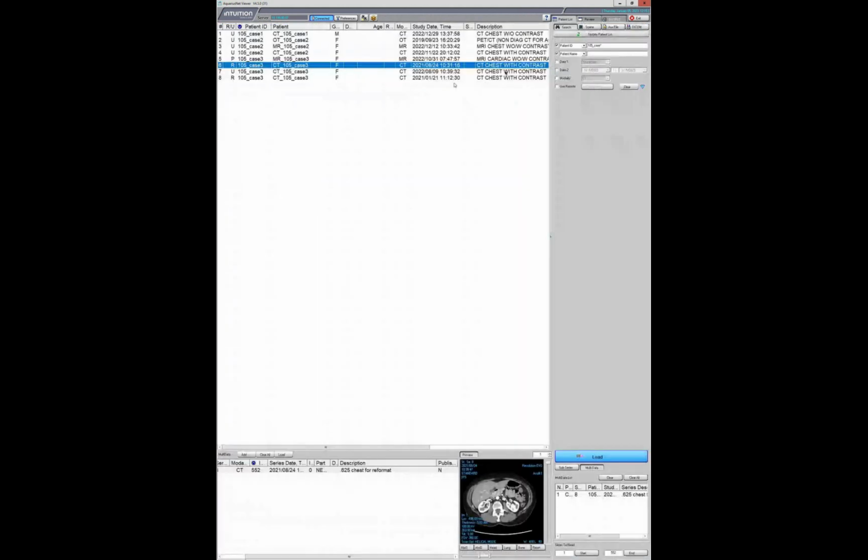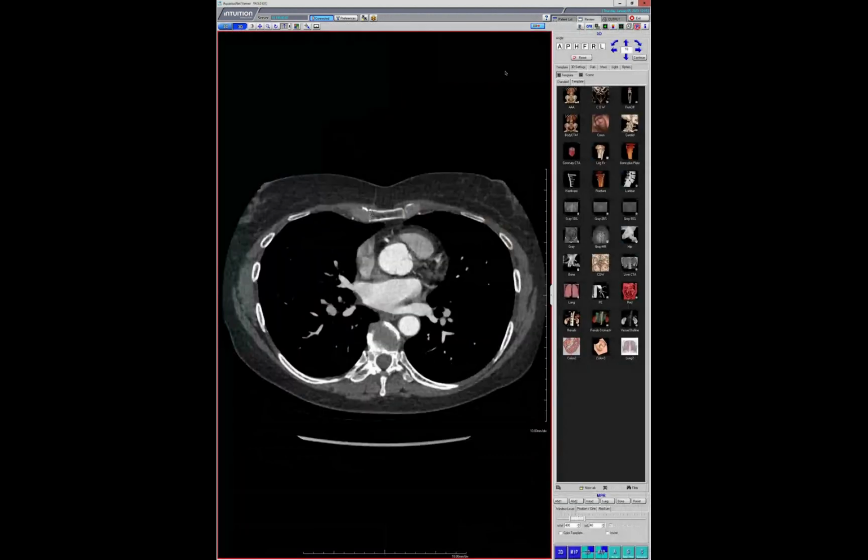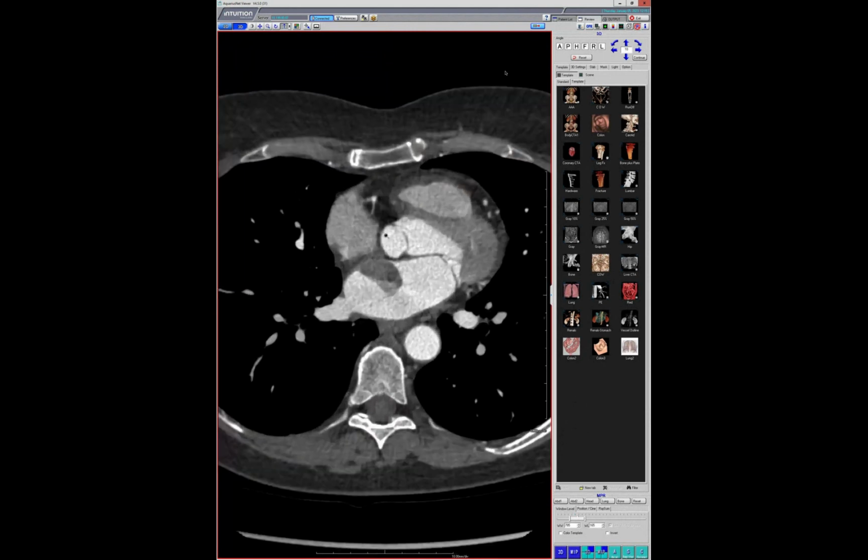It may have been actually on that one, but I don't think they acted on it. And then here she is a year later, and this thing is quite big. So it went from just a little bit of thickening along the septum to a little bit more nodular to a pretty big size mass in a year and a half.